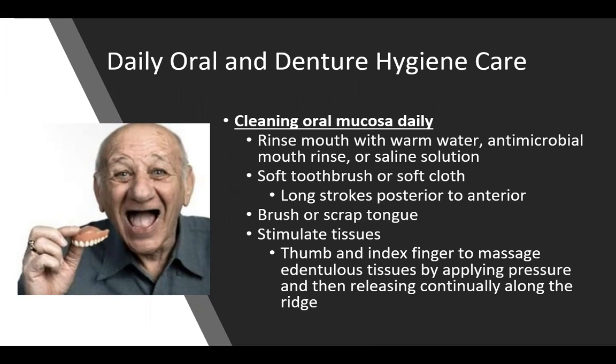They can massage the ridge, the edentulous tissue, by applying pressure and then releasing. So just massage the whole ridge, and you can demonstrate that on them by rubbing your thumb and index finger along the ridge, gently massaging it and pinching it.